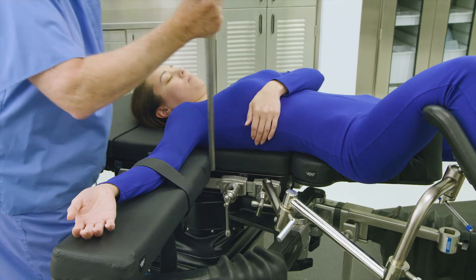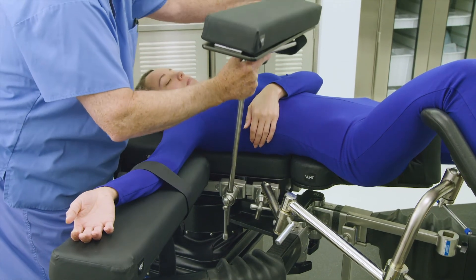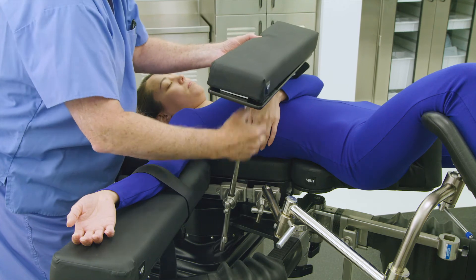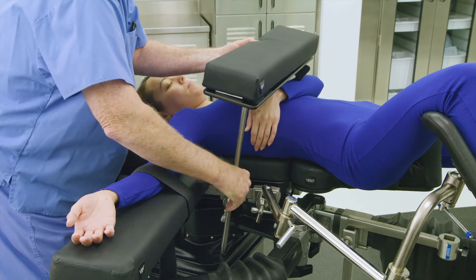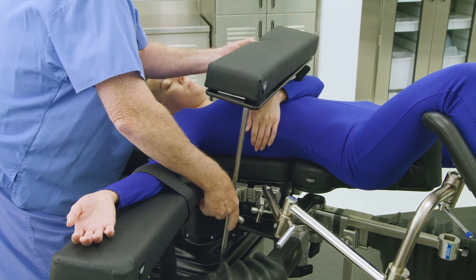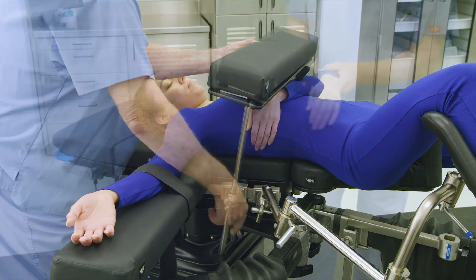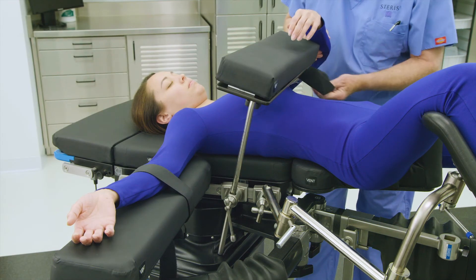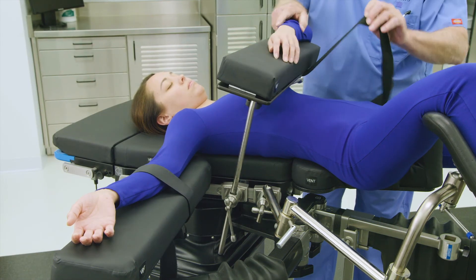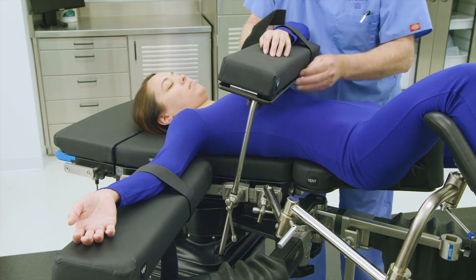Next, mount the multi-position arm board into the socket clamp. Adjust the height and position of the arm board above the patient's torso and tighten the socket clamp to secure. Place the patient's operative side arm into the multi-position arm board and apply the safety strap to secure the arm.